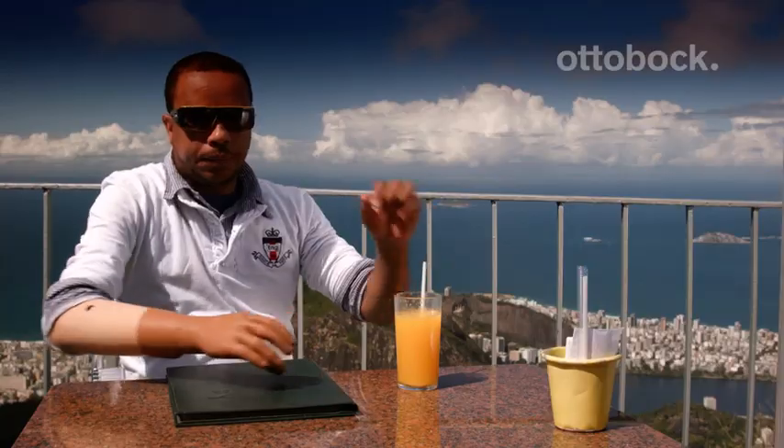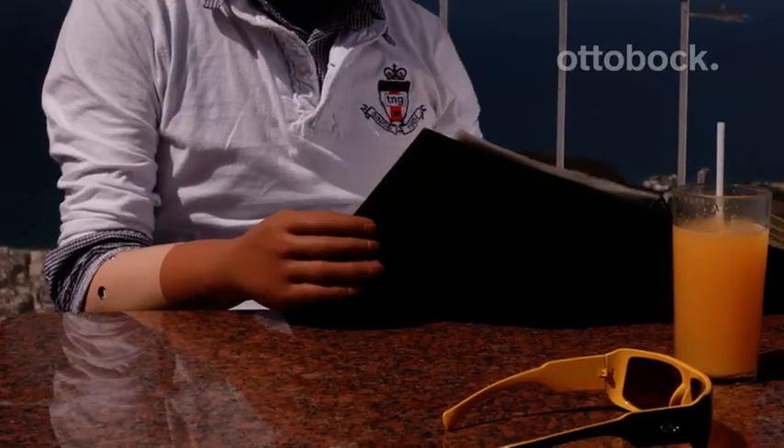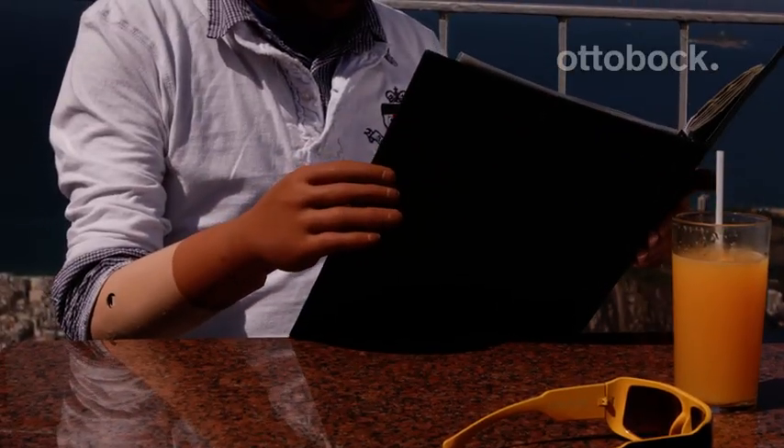A friend of mine has a samba group and every once in a while he asks me to play with them. Today I'll play as well. The prosthesis helps a lot when holding the tambourine, for example, which the other one couldn't do. I played in a samba school before and I also play the surdo bass drum and the cuica friction drum.